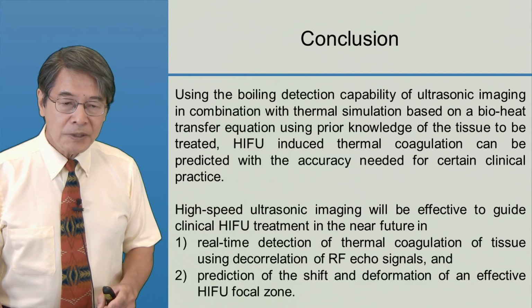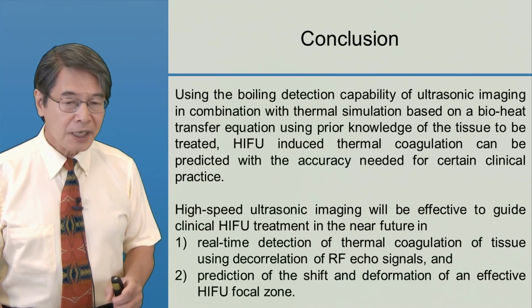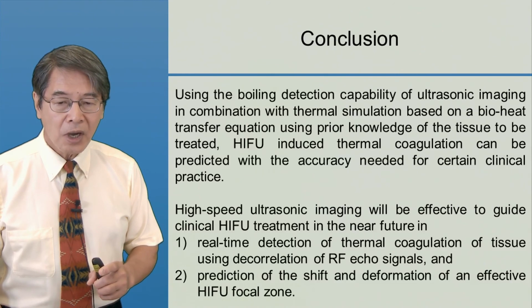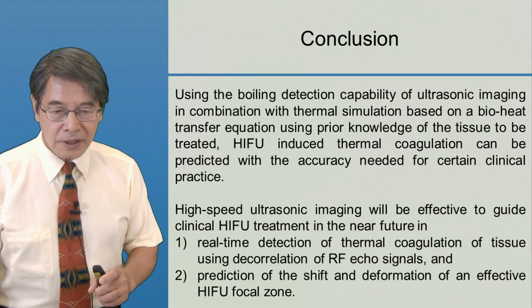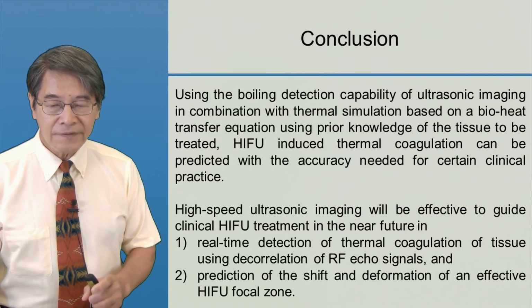High-speed ultrasonic imaging will be effective to guide clinical HIFU treatment in the near future, in real-time detection of thermal coagulation of tissue using decorrelation of the RF echo signals and prediction of the shift and deformation of an effective HIFU focal zone.